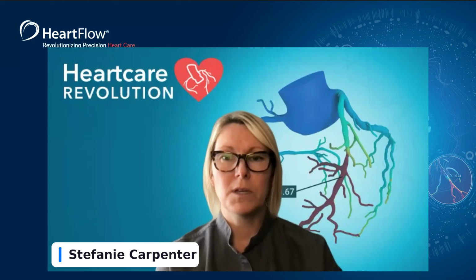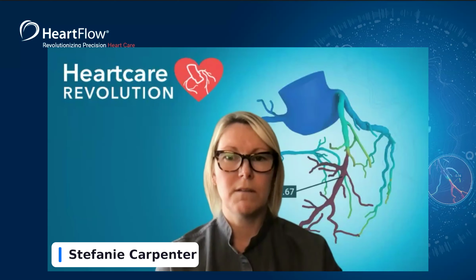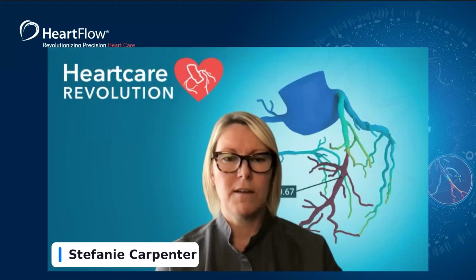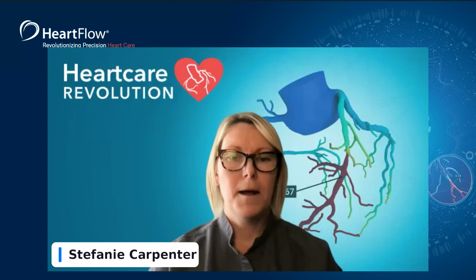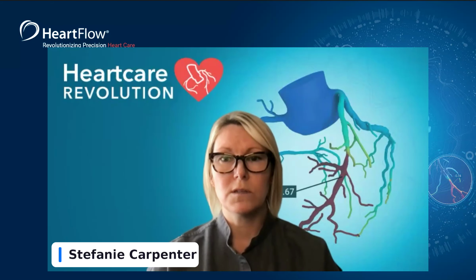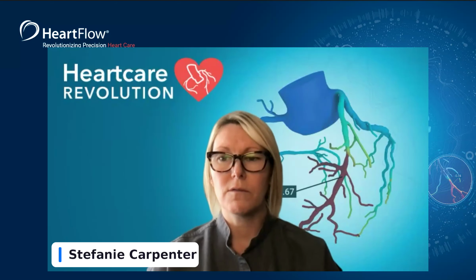We typically like to have 40 to 80, and diastole happens around 75% in those stable heart rates. So 75% is kind of the sweet spot. So we wouldn't be able to get that 75% if you're doing your full dose from 40 to 70. You'd still be able to reconstruct it, so it would still be available for you. It just wouldn't have as good image quality as those other phases have.